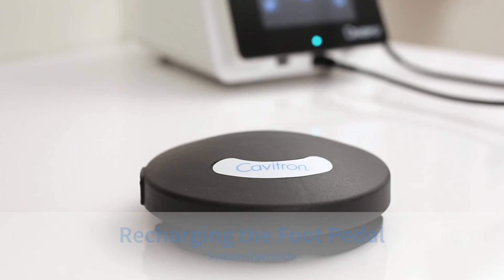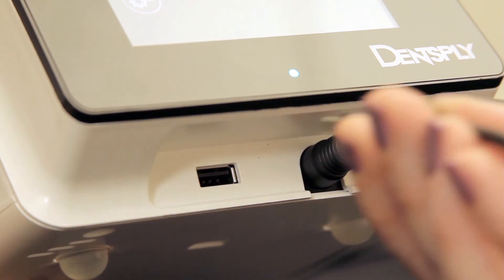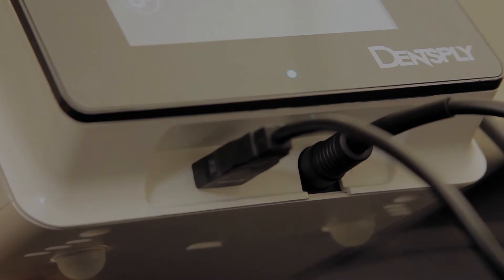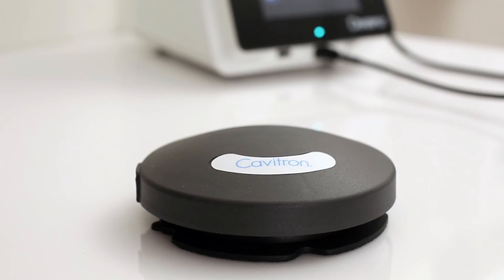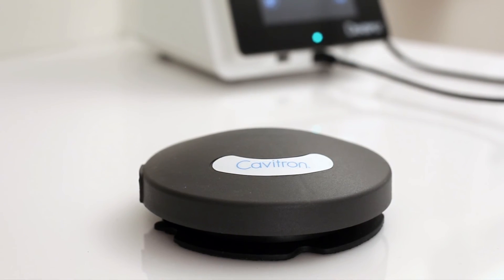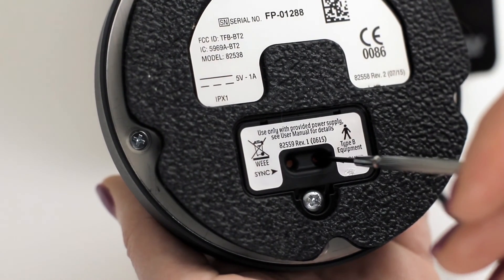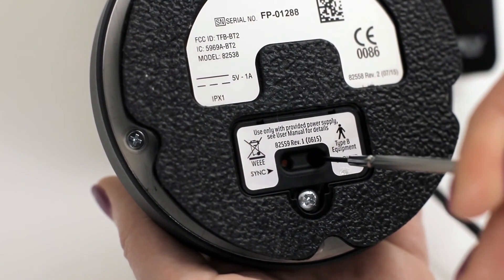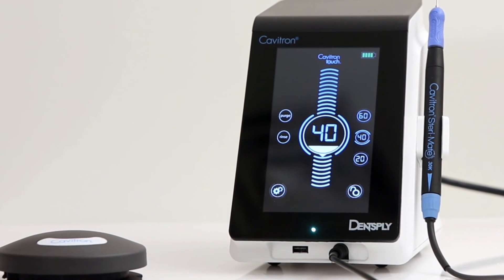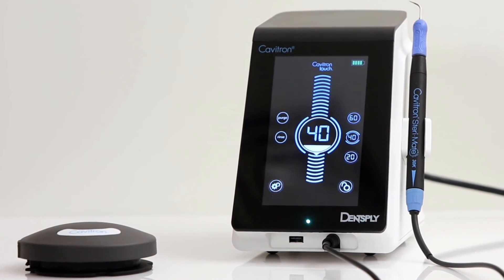Recharging the tap-on foot pedal. With the unit powered on, plug the auxiliary foot pedal cable into the foot pedal and the USB port on the front of the unit. The foot pedal is packaged with the power off and must be turned on prior to use. The foot pedal will not charge in the off state. To turn on the foot pedal, press and hold the power button for 4 seconds. Allow the foot pedal to charge up to 4 hours to achieve a full battery charge, which will be visible by the battery charging icon that appears on the screen. The unit will operate with the foot pedal while the battery is charging.